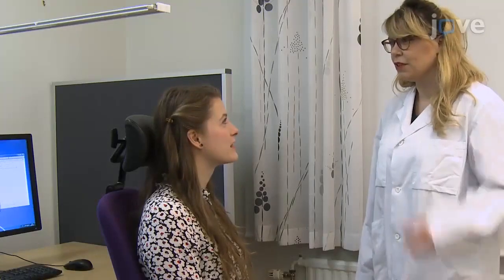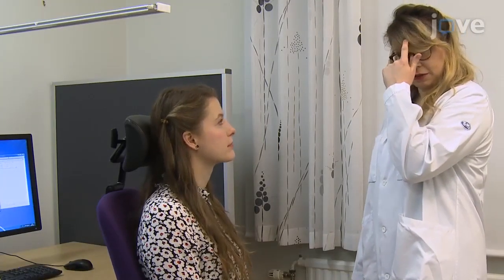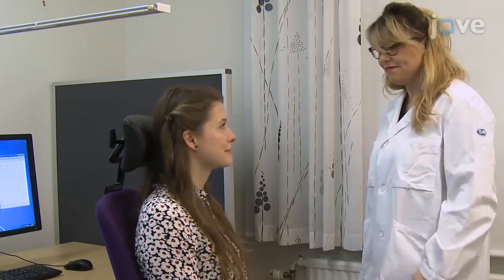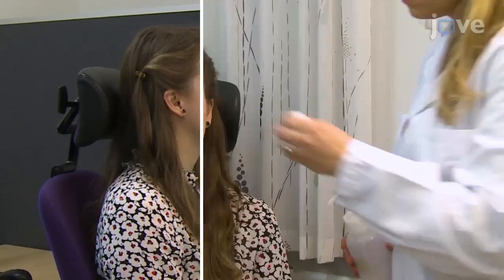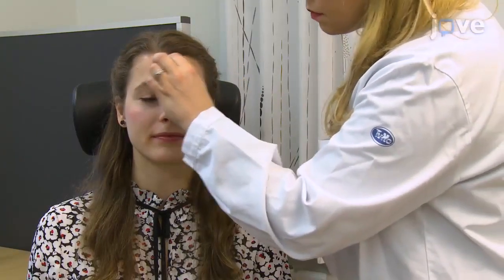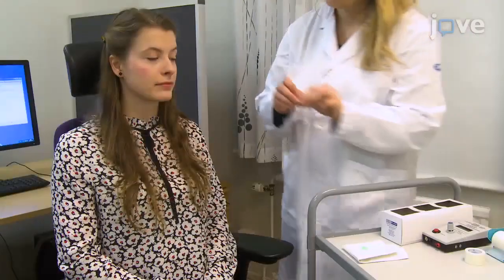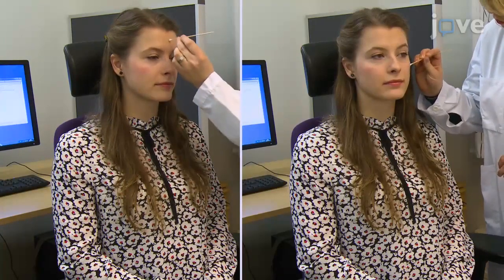Begin by informing the participant of the electrode sensor application process, in which the purpose is to measure muscle and sweat activity during the session. Then use water to clean the participant's skin where sensors will be applied. Use an exfoliant scrub to lightly abrade the same areas.